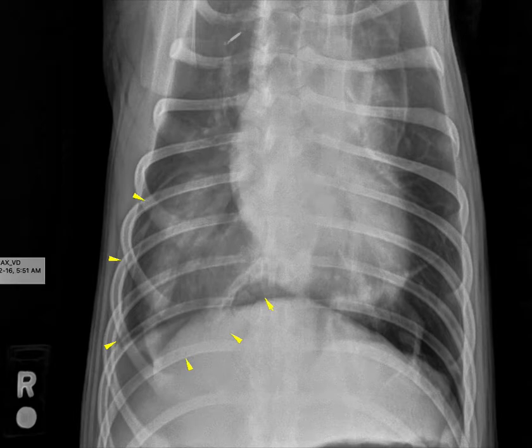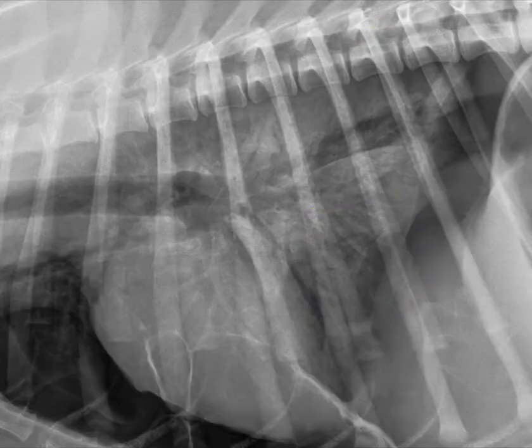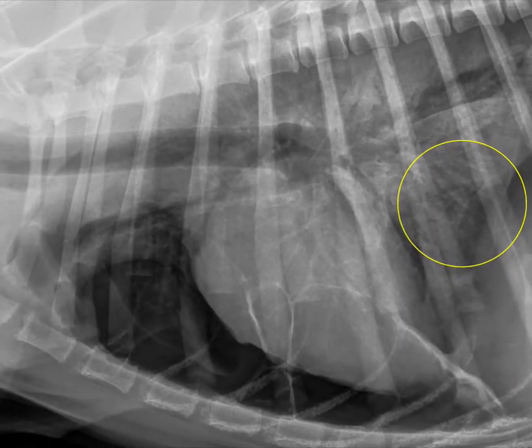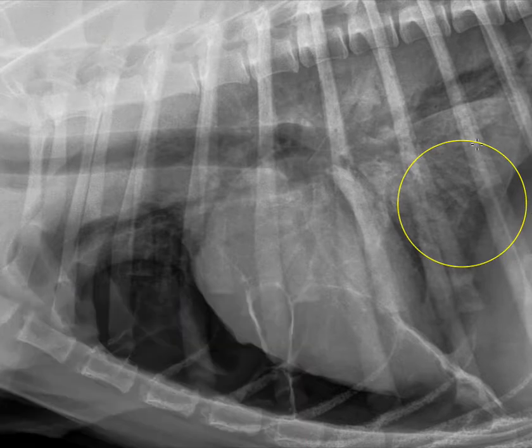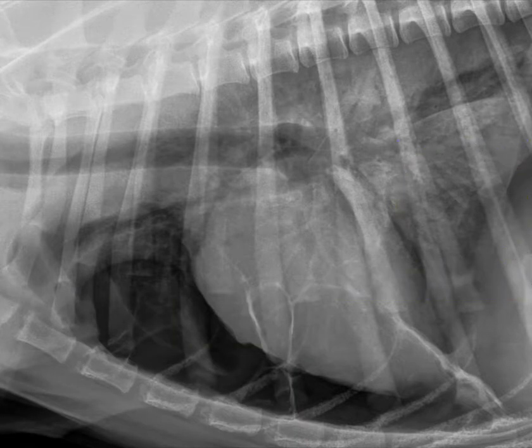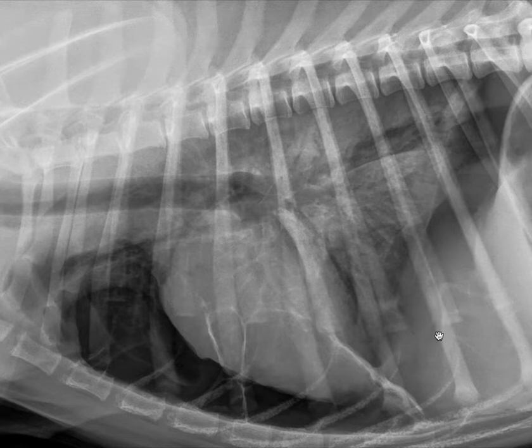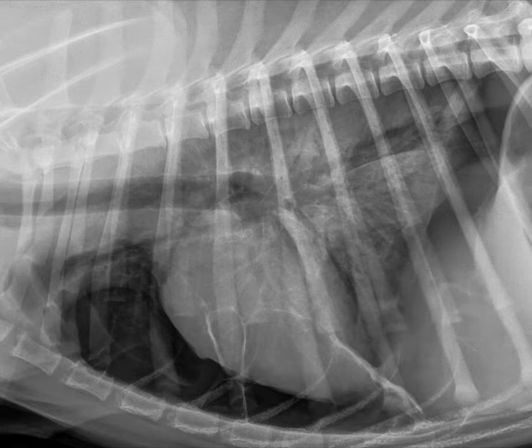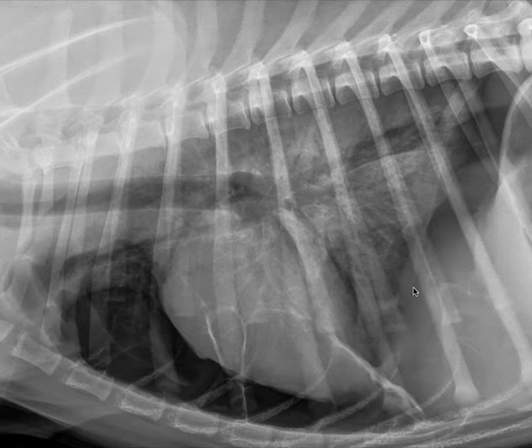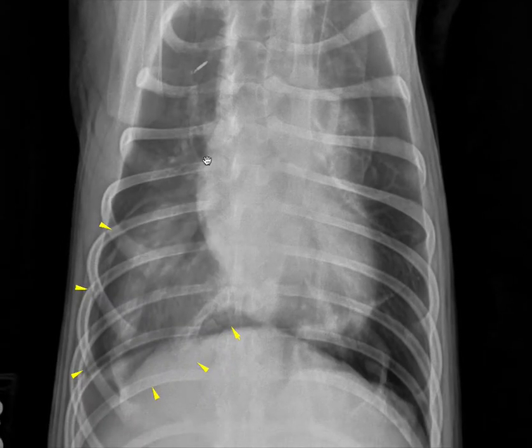For this case, the lung pattern — whether we agree on interstitial or alveolar — either way it only gets us so far. The next thing we want to know is what's causing the lung pattern. It's really hard to talk about lung patterns without talking about distribution — where the lung lesion is located. This case gives us a chance to compare interstitial and alveolar in the same patient, and also presents a marked distribution I would characterize as caudodorsal. The worst affected lung lobe is the right caudal, so this is a fairly caudodorsal distribution. Some people might call it asymmetric as well.